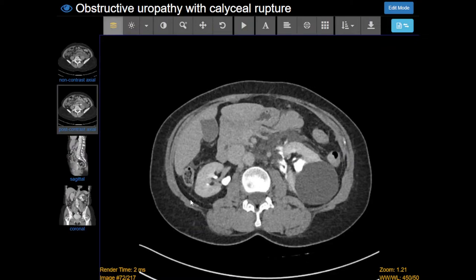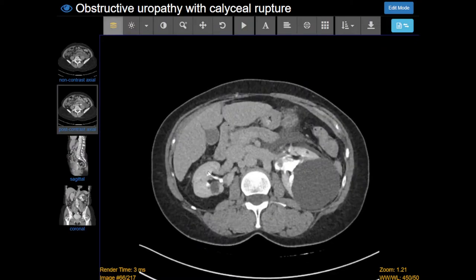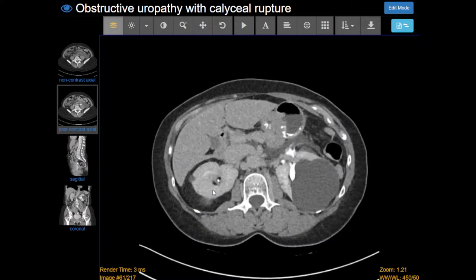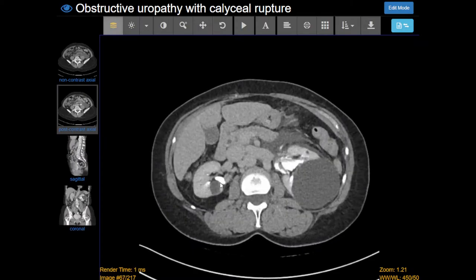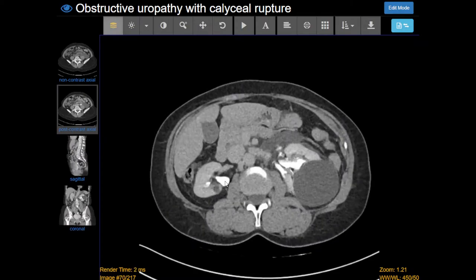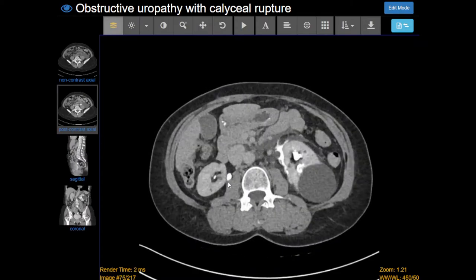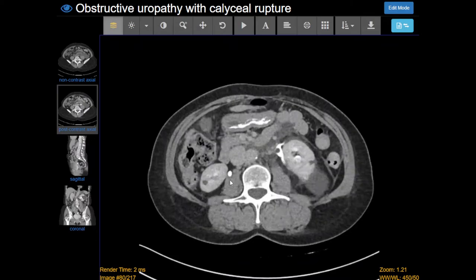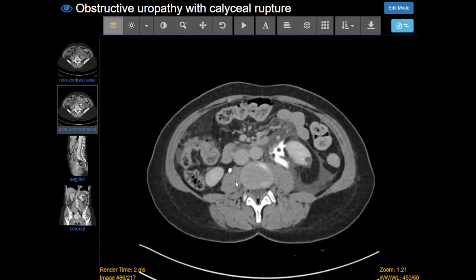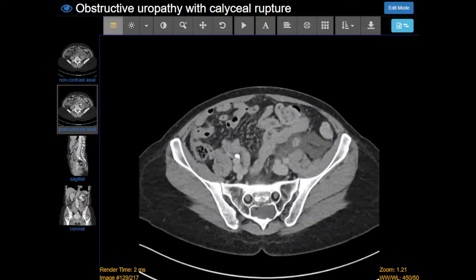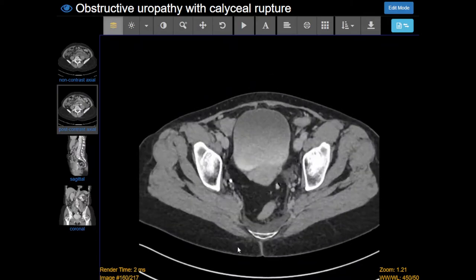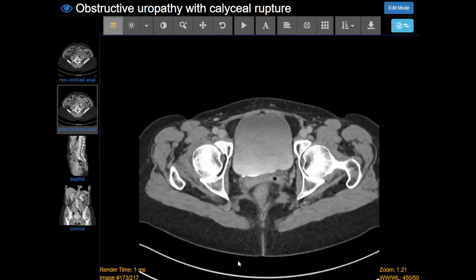We'll start with the right side because this is the normal side. The kidney enhances, and we have some renal cysts. We're able to follow the contrast that's in the urine down the ureter all the way into the bladder.